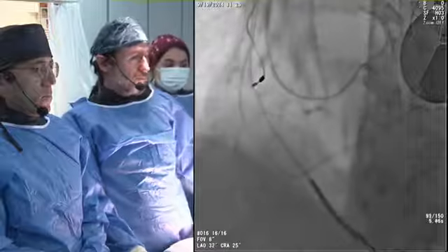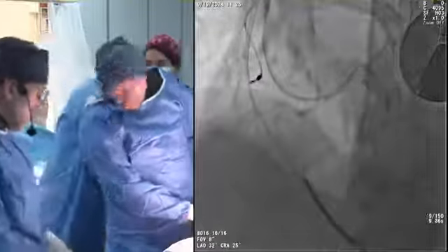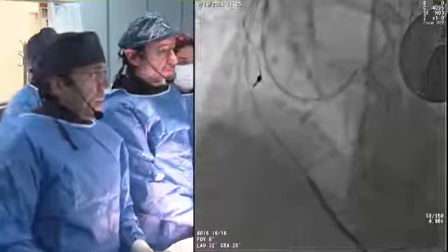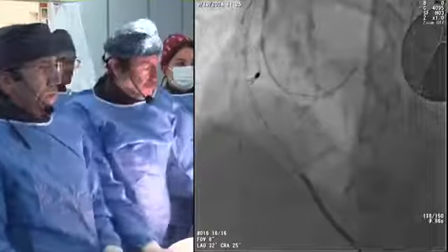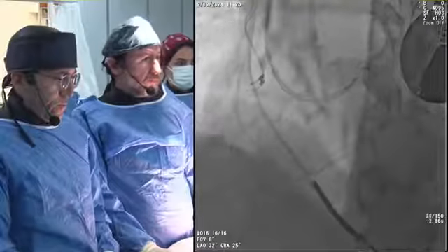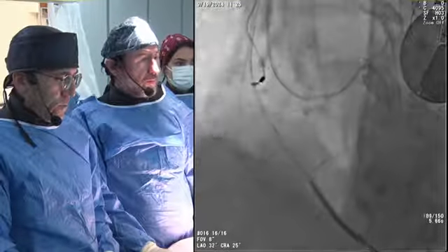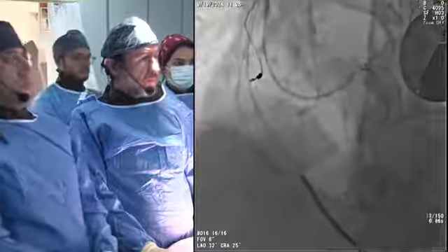Any comment? Shevket, for such a case, as a first wire to reach the ostium. Yep. Usually I choose UB3, for example, as a first wire. And after reaching close to the ostium, maybe I change it to wires like Conquest Pro 12 or Hornet.